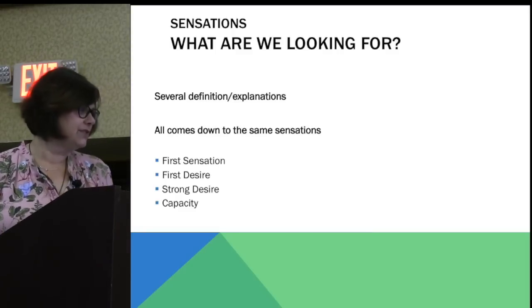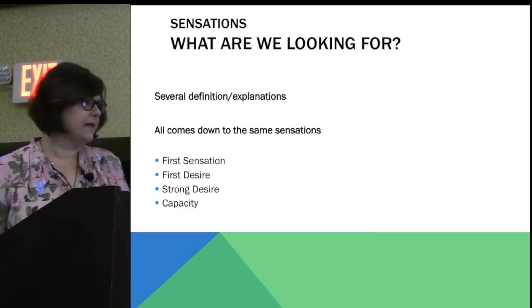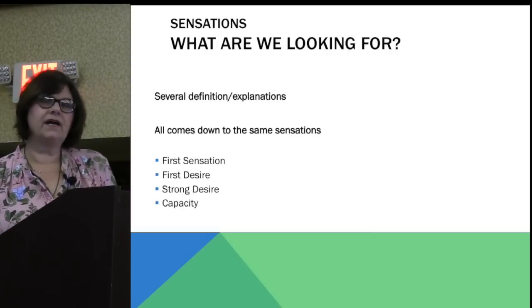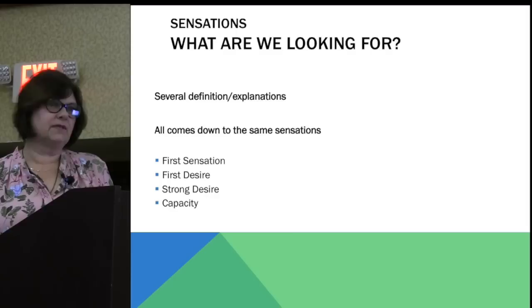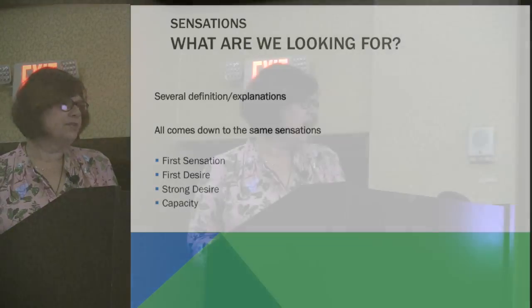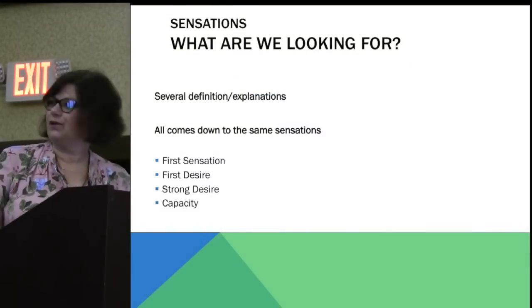Okay, and then these are the sensations that you look for during urodynamics. Just very basic. First sensation is I can feel the water going in. First desire is, yeah, I think I could use a restroom. It's not overwhelming, but definitely I could. Strong desire is I'm looking for the restroom. I definitely need to go. And capacity is I'm going. I can't take it anymore. That's general terms.